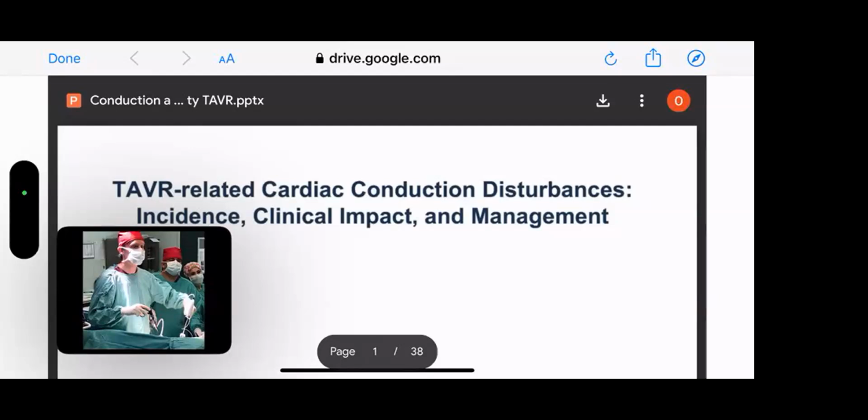Do you put pads on? I'm really speaking for the physiologist here. Obviously you put a temporary pacing wire in, so can you go into that a little bit for the physiologist, and what rate do you normally pace the pacemaker when you're deploying?